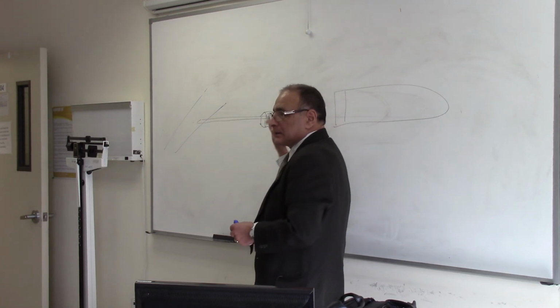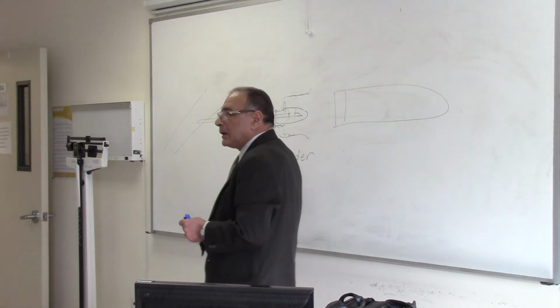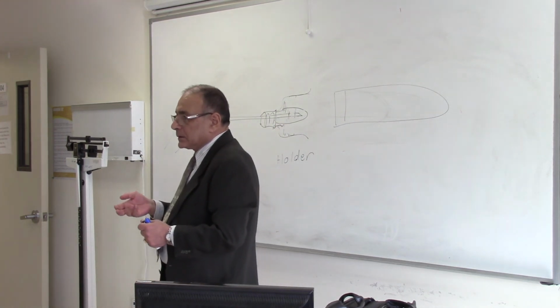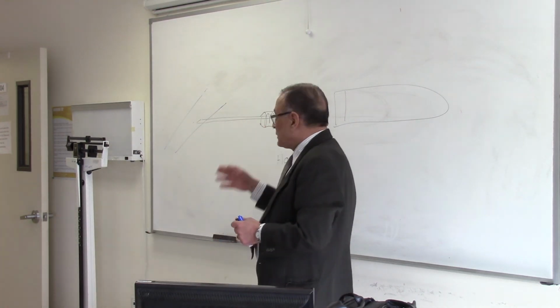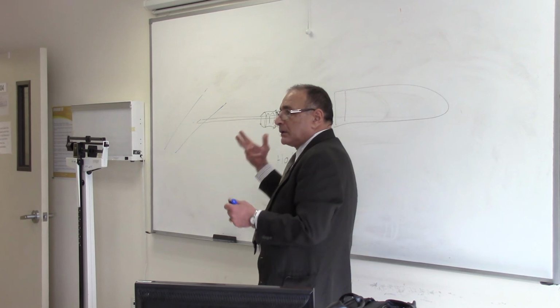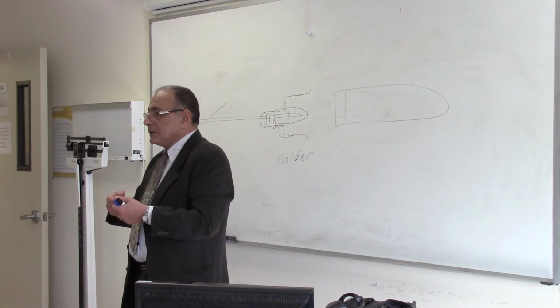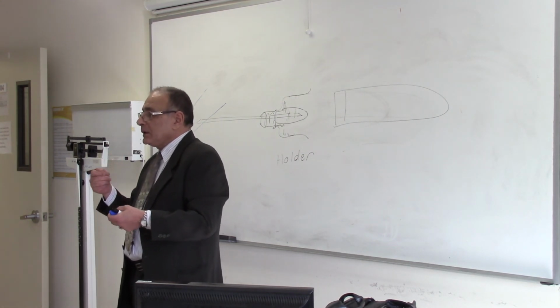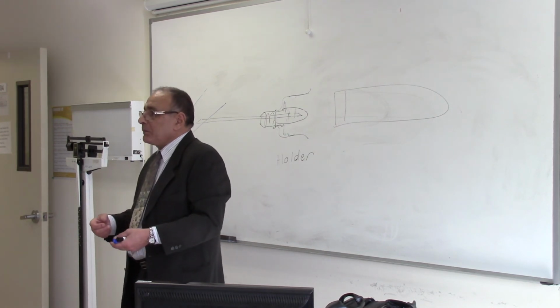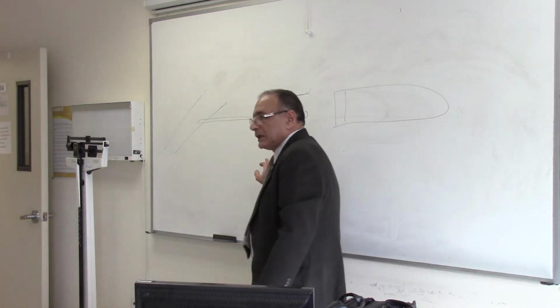That clear? And that is a system having the advantage over the syringe, because here you can take as many samples as you want. How many samples do you want? 2, 3, 5. You can just remove the tube, put the next tube, remove the tube, put the next. But when you use a syringe, when it's full, it's done. You have to withdraw the needle, and if you need another tube, you poke the patient again. How about if you have 5 tubes? You poke the patient 5 times. So this has the advantage.